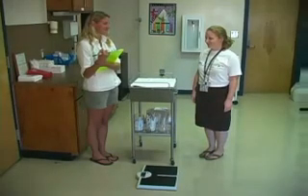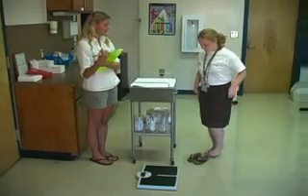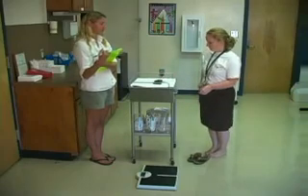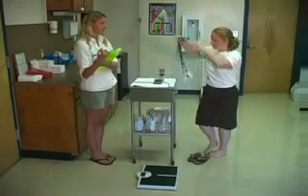The first step in measuring weight is to ask the student to remove shoes and all belongings from pockets, such as keys and cell phones. Also, remove any extra clothing, such as a jacket, sweatshirt, or sweater.